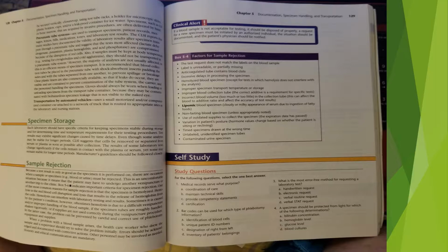One of the most common reasons for sample rejection is that the specimen is hemolyzed. Hemolysis is the disruption and lysis of red blood cells that results in the release of hemoglobin from the cells. Hemolysis can interfere with laboratory testing and results. Sometimes it is caused by the patient's condition. However, oftentimes hemolysis is due to a difficult venipuncture and/or improper handling of the blood sample, if the specimen tubes are roughly handled, shaken vigorously, or if supplies are not used correctly during the venipuncture procedure. In the latter case, the problem can be prevented by careful and correct use of phlebotomy equipment and supplies.